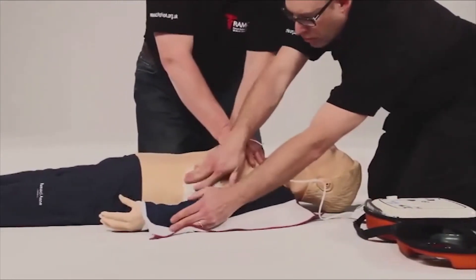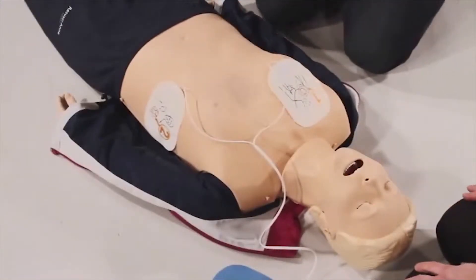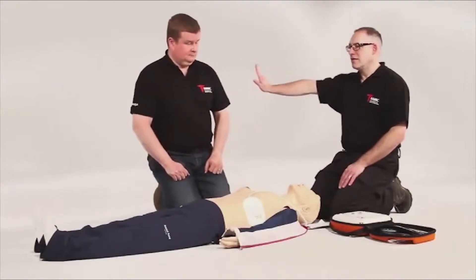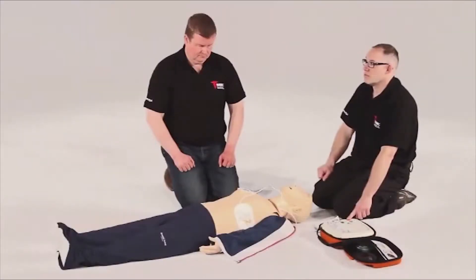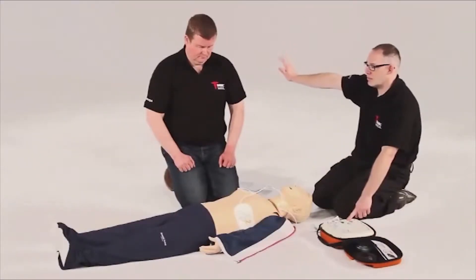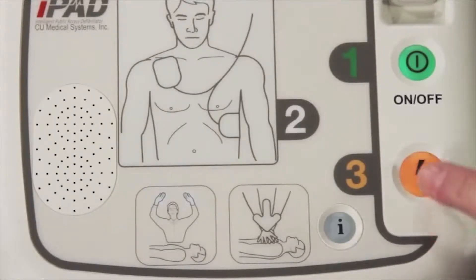The iPad SP1 AED will then prompt you to ensure that no one is touching the patient. Stand clear. If a shock is advised, the iPad SP1 AED will charge to a predetermined level and advise you to once again check everyone is standing clear, and then to press the flashing orange shock button.